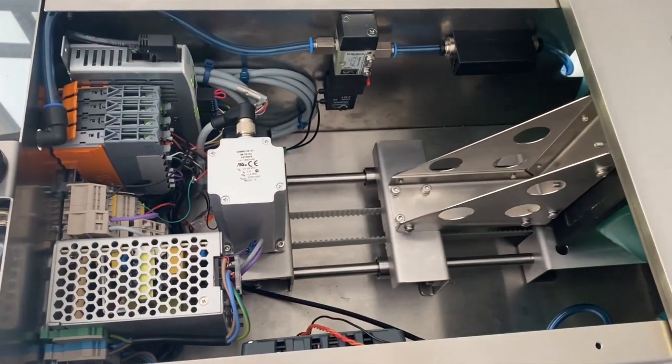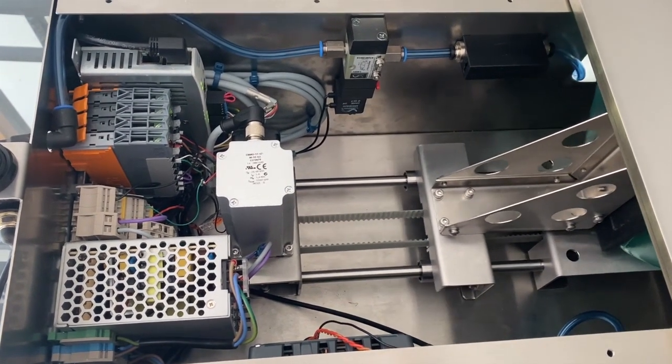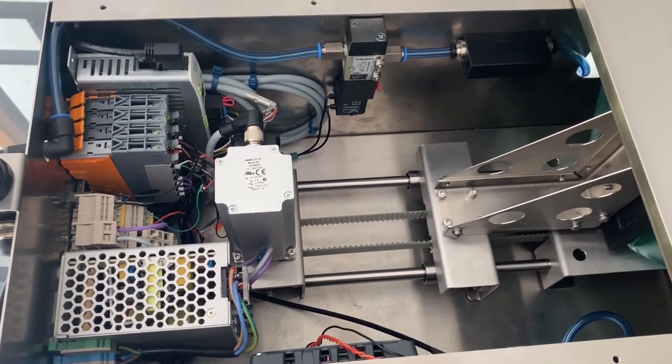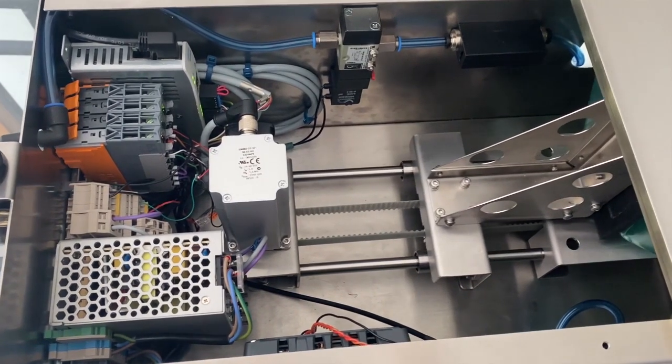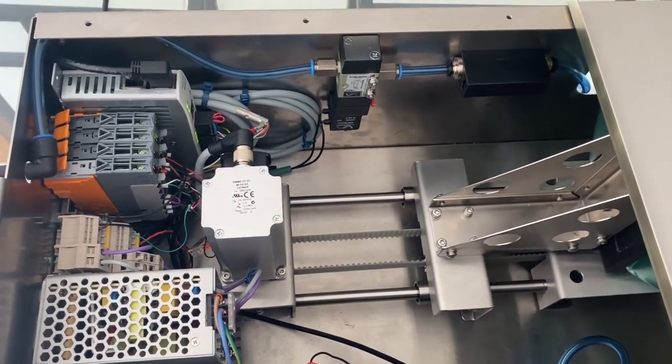We have, for example, also used a simple motor and belt drive rather than proprietary linear actuators. The prime reason being that although we have of course chosen specific manufacturers for these components, the degree of interchangeability is far greater if supply became an issue.